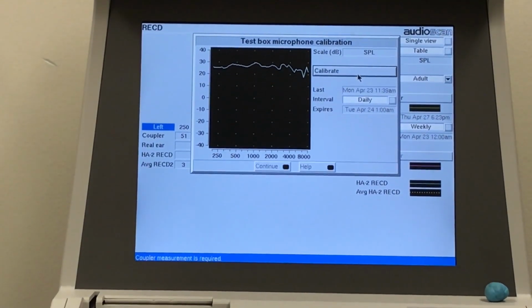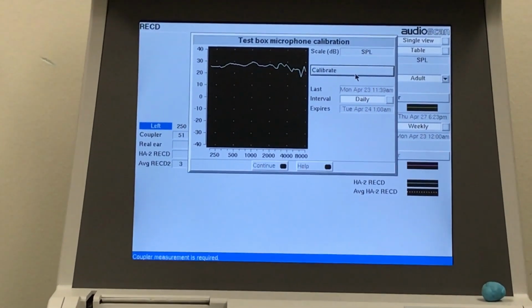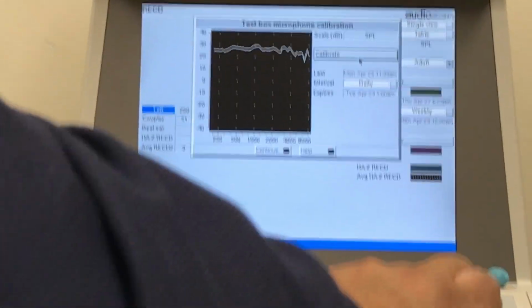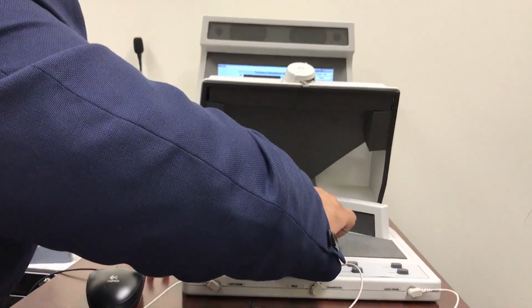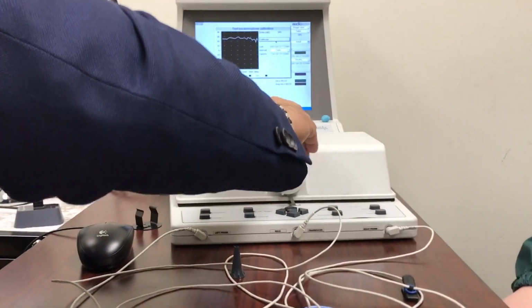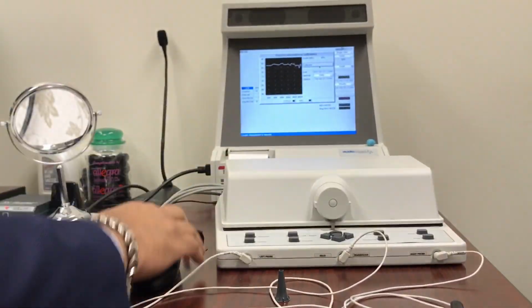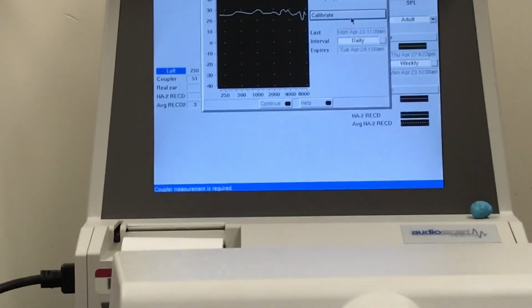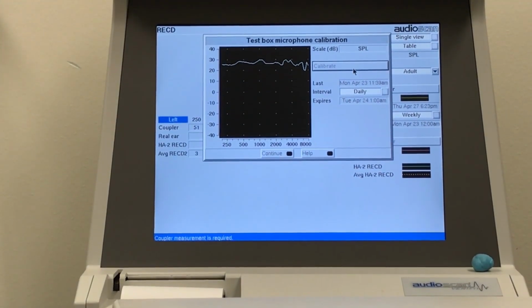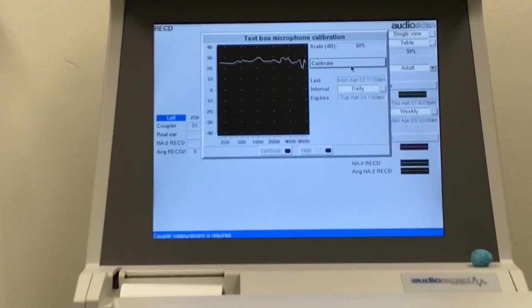Some of that may be this fan noise. Some of it is us clanging around here. Turn the fan off if you don't mind. That didn't really help any. But anyway, again, this is to let the loudspeaker be. You can turn it back on.